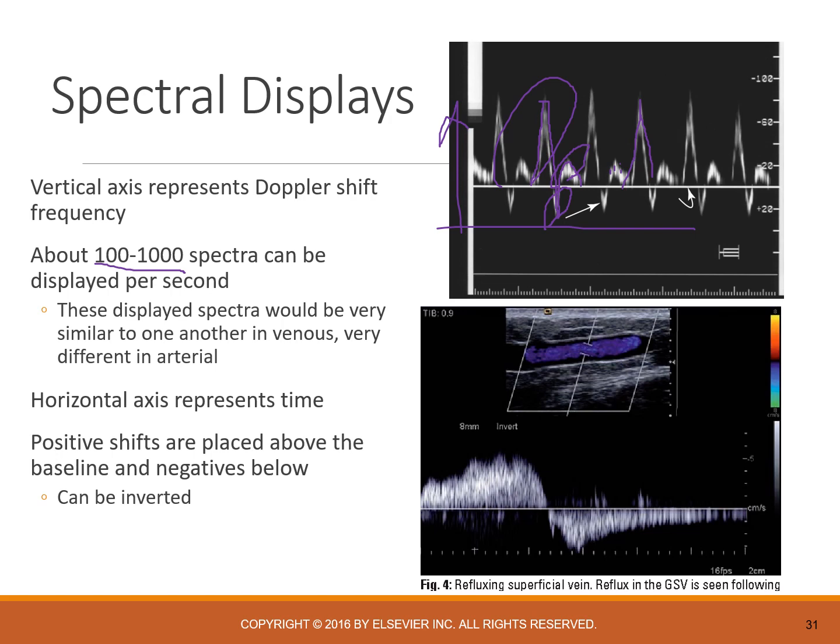Now, this is an example of a venous waveform. Like we talked about originally, venous waveforms aren't controlled by the heart pump. They're really controlled by pressure gradients. And so, in this particular case, you can see that there's forward blood motion, it stops, and it reverses.